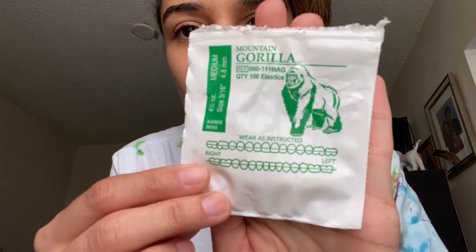I have elastics and they're the same size — they're the gorilla strength — but they have changed direction. So not on one side anymore, it's on two sides. I'm going to show you really quick what mine is.